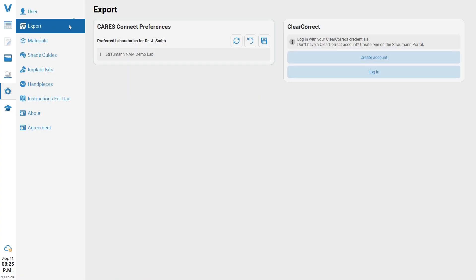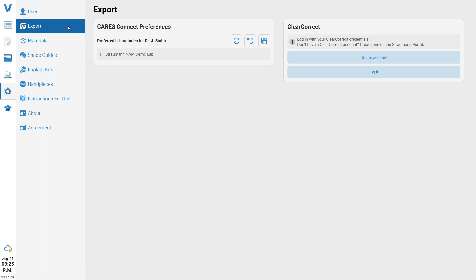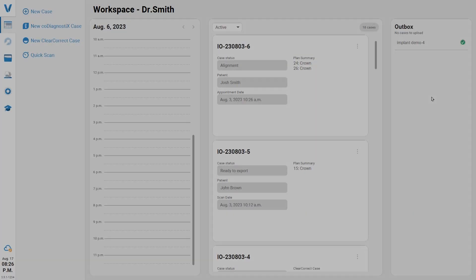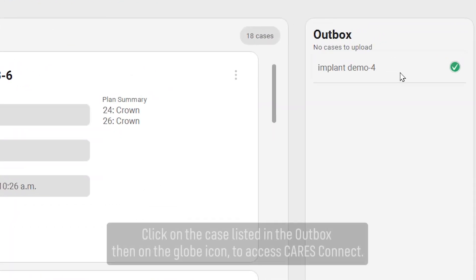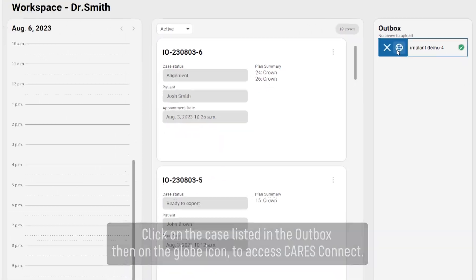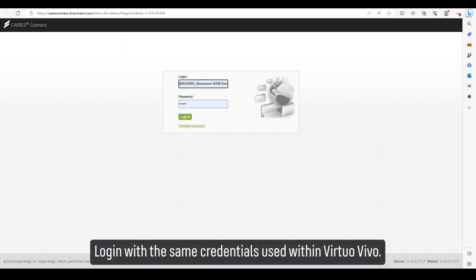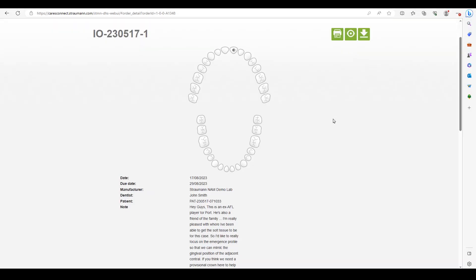When logged in as a user, only the laboratories will be seen on this screen. When a case has been exported using the Cares Connect export, click on the case listed in the Outbox, then click on the globe icon to access Cares Connect. Log in with the same credentials used within Virtual Vivo.